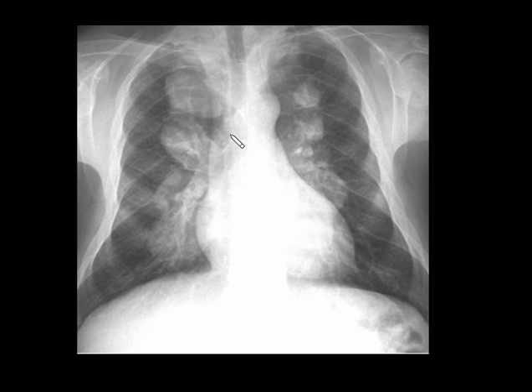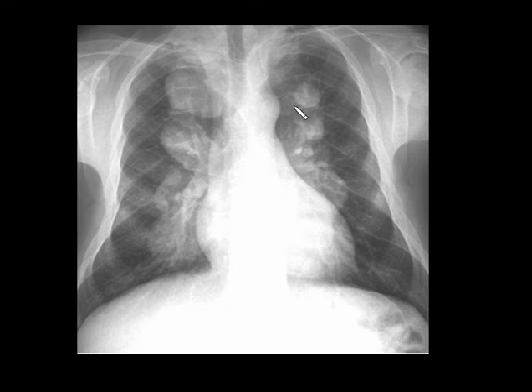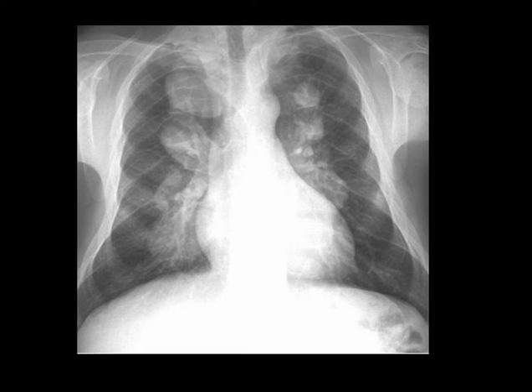Coming to the next spotter, you can see a lobulated soft tissue density in the posterior mediastinum at the level of costovertebral junctions with widening/expansion of the posterior ends of the ribs — classical for extramedullary hematopoiesis. It usually affects visceral organs like liver, spleen, and lymph nodes. In the thorax, the classical location is the costovertebral junction, posterior ends of the ribs, and the posterior mediastinum. Consider myeloproliferative disorders and hemoglobinopathies when you see this finding.